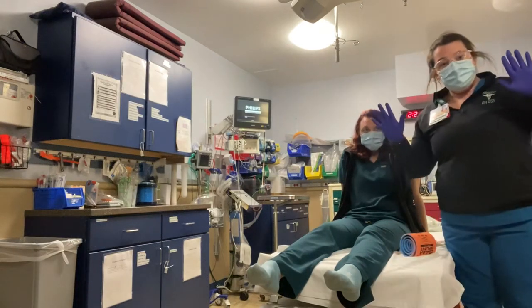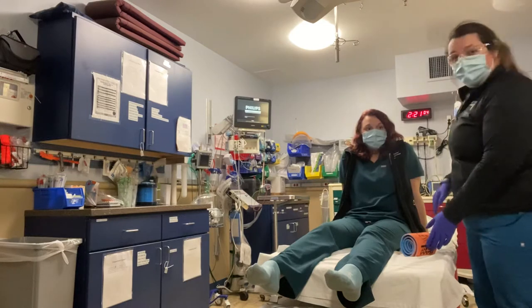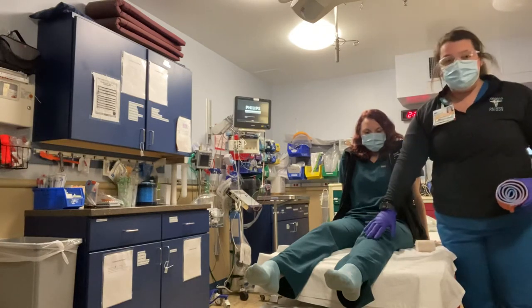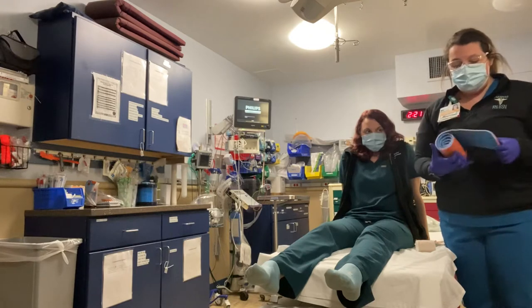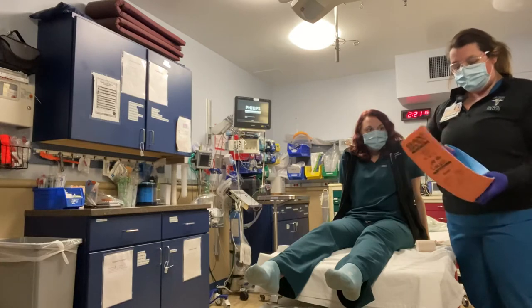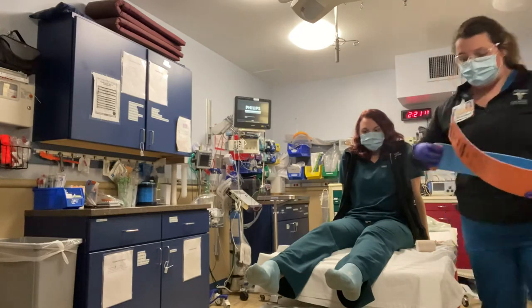I have my BSI on. The scene is safe. My patient has a left lower leg injury. We're going to apply this splint. I'm going to measure her good leg with this splint.